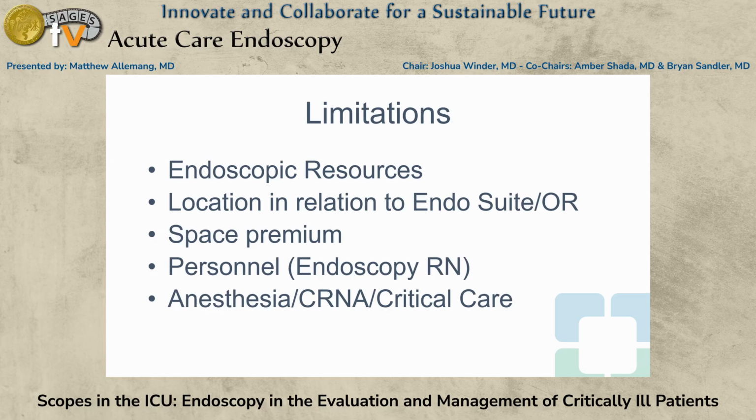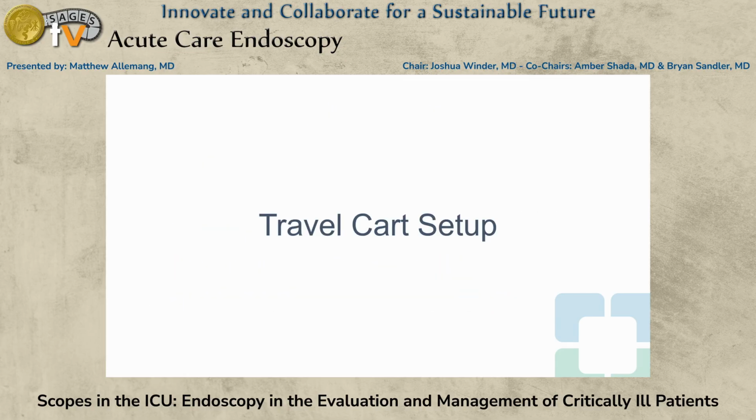You need to remember that you don't have all your resources. You're sometimes far removed from the endo suite or the OR where all of your extra implements are being held, so bring whatever you can as you come. Space is sometimes at a premium. You're sometimes limited in the number of endoscopy RNs that will come and help you out. If it's just one and they're bringing the cart, it's just you, it's a little bit tougher. And sometimes there's availability for help with sedation, depending on your local environment.